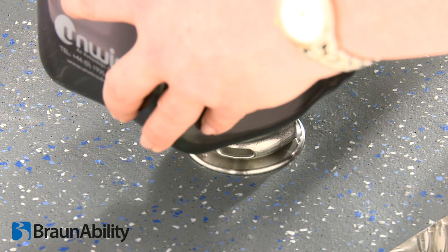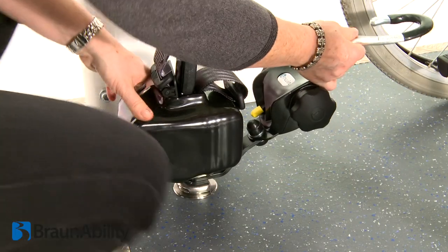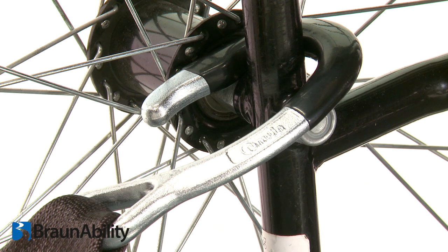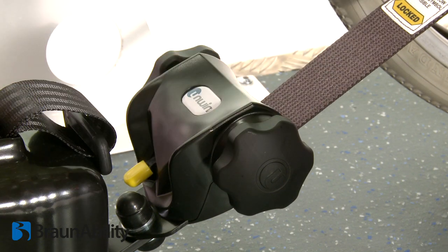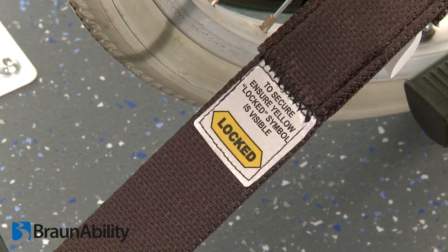Slide the cleat fully home and rotate the assembly through 90 degrees. Extend the webbing and attach the hook to the designated rear attachment point on the wheelchair frame. The self-tensioning mechanism will remove any slack in the webbing. The yellow positive locking label must be clearly visible.